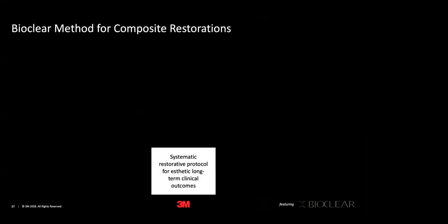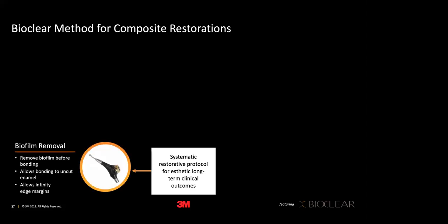So let's go over the basics of the Bioclear method. Number one, we have to disclose and remove biofilm because we're no longer cutting the tooth. It's critical that we use disclosing solution to help us to see the biofilm. Phosphoric acid does not remove biofilm.